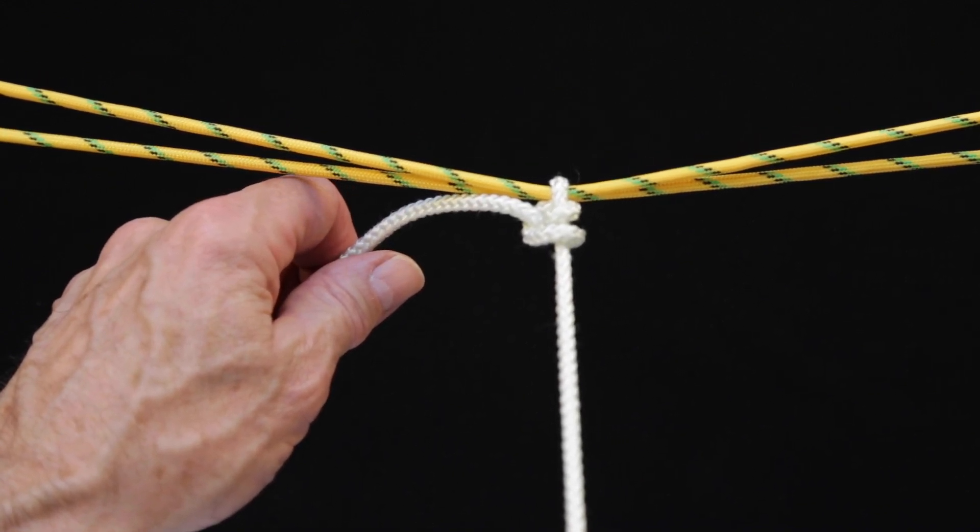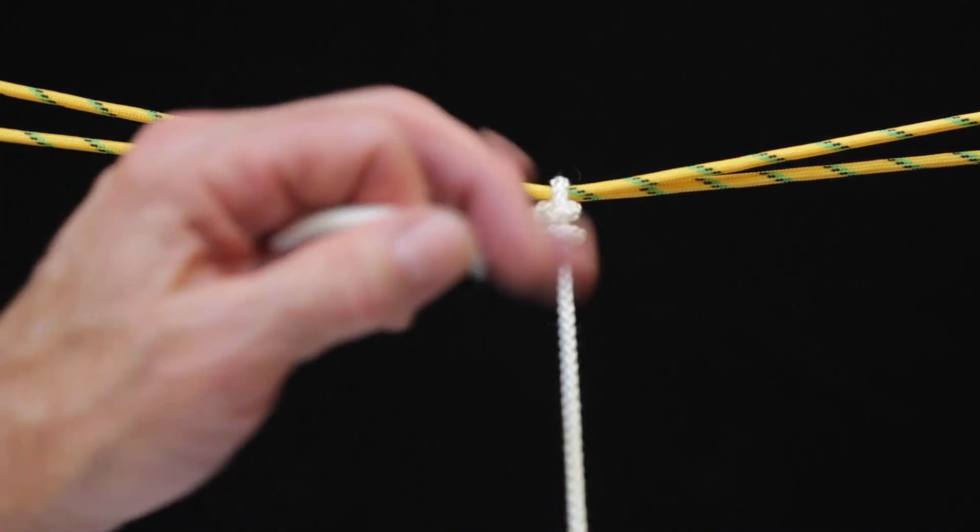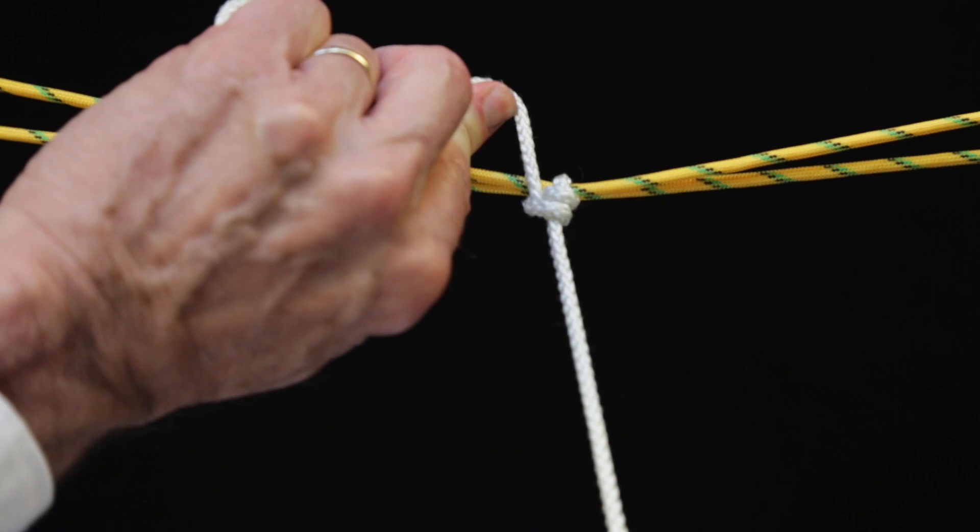Only then does my left hand have anything to do. Pull down and away on the loops to tighten the knot and prevent further sliding.